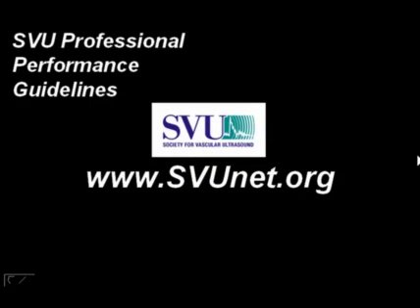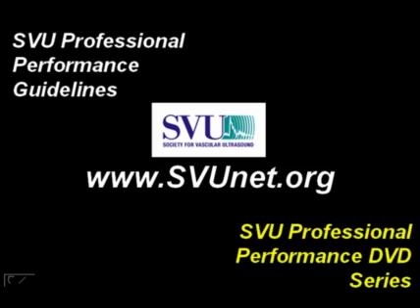Now, that's the evaluation of the patient with carotid artery disease in terms of the use of carotid duplex ultrasound. If you want more details about these professional performance guidelines, I would refer you to SVU's website, www.svunet.org, and very soon we'll have some DVDs that will also go over the technical performance of these examinations.